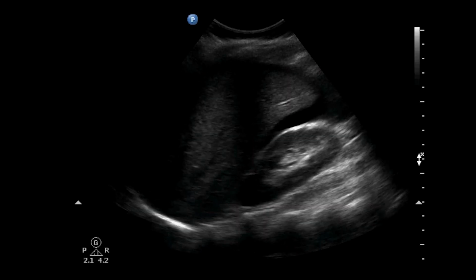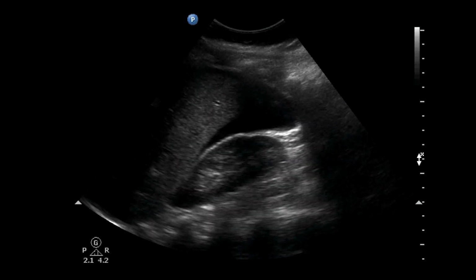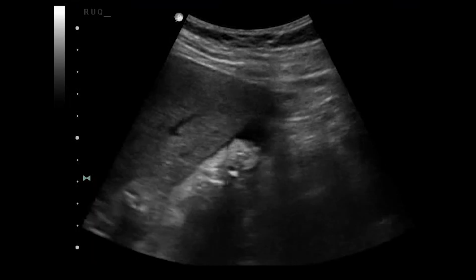For good measure, here is another example of a patient with a positive right upper quadrant exam. Here's another example.